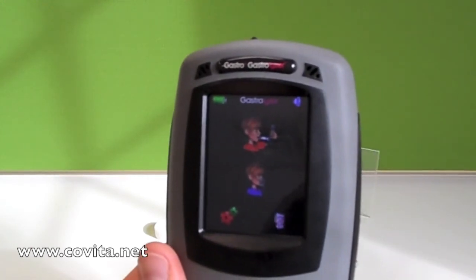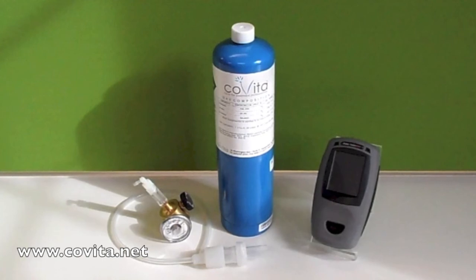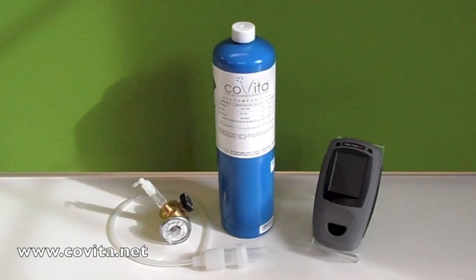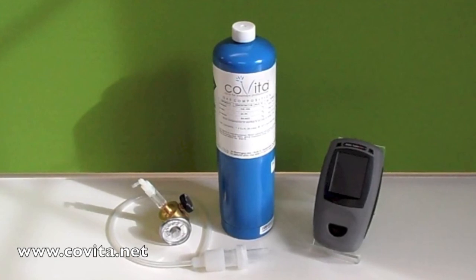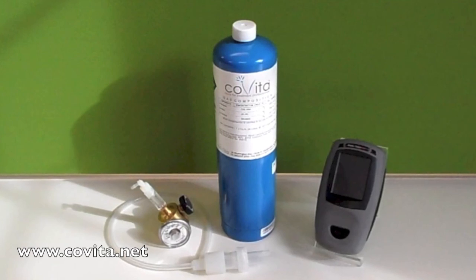Your monitor is now successfully calibrated. It is best practice to remove the flow meter regulator from the canister when not in use, and to replace the dust cap onto the canister of gas. If you have any questions, don't hesitate to contact Covita. Thank you.